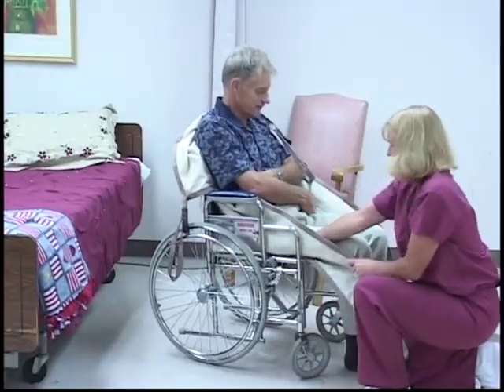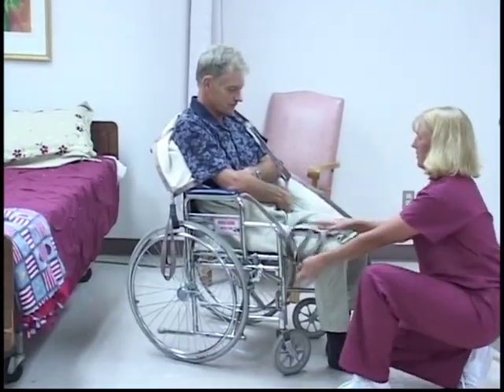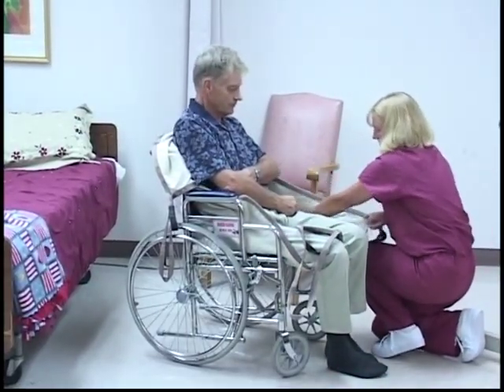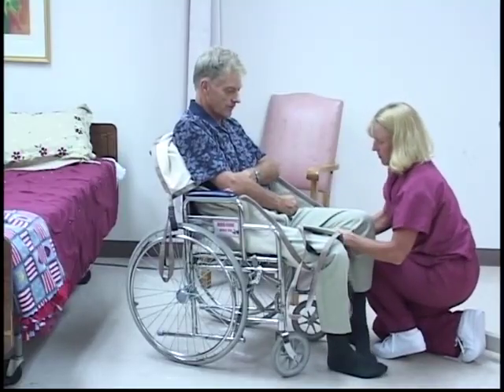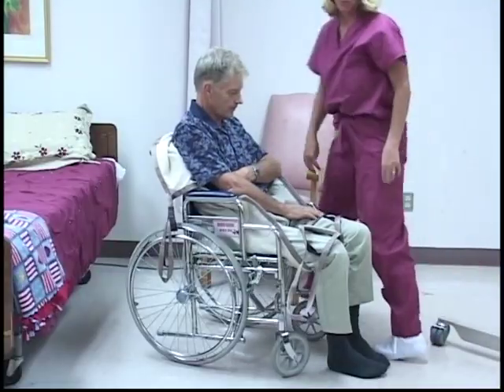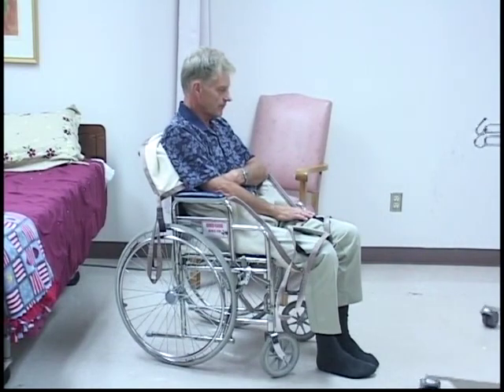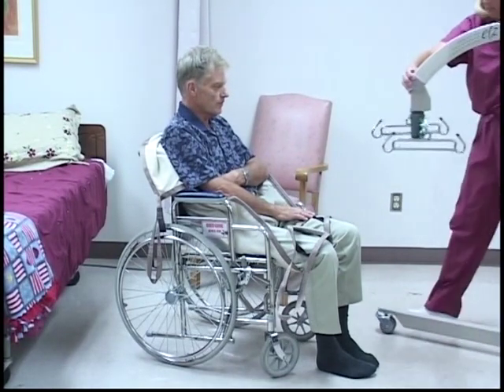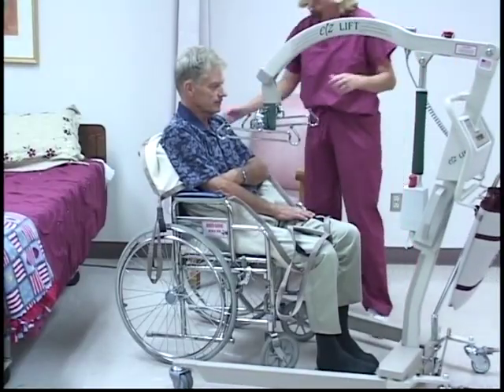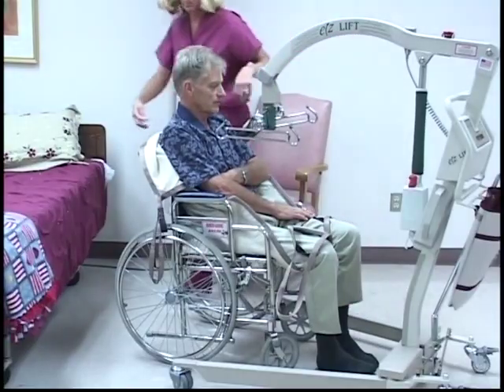Position the wings along the inside of the chair. Place your hand between the patient's hip and sling with your fingers pushing down on the edge of the sling to the chair bottom. Lift the patient's left knee and with a tug, pull the left wing of the sling under the hip and thigh. Place the excess sling over the left thigh. Repeat this procedure on the opposite side. This procedure will ensure that the sling is under the patient's bottom, with the patient's weight evenly distributed on the sling. Use the spreader bar to spread the legs wide enough to straddle the wheelchair.